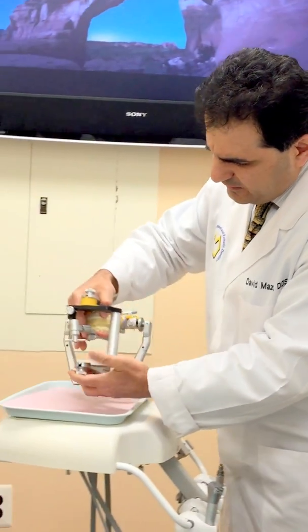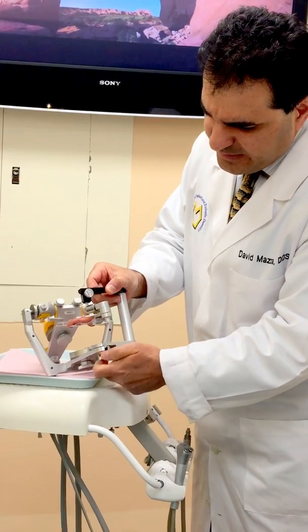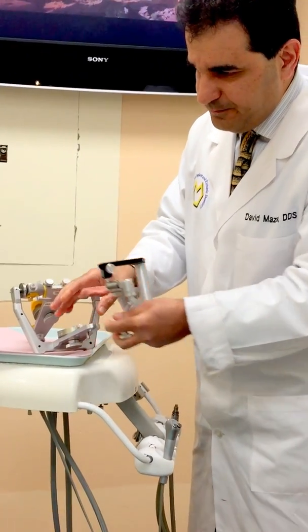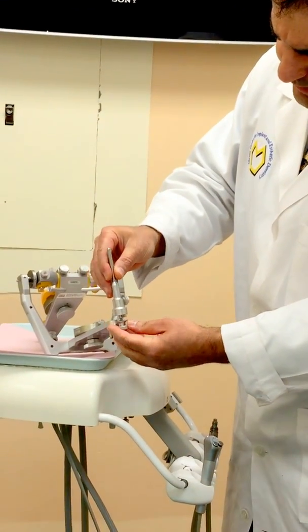I'm going to remove that axioquick transferable system, and I'm going to be replacing it with an incisal pin. So the incisal pin is going to be placed.